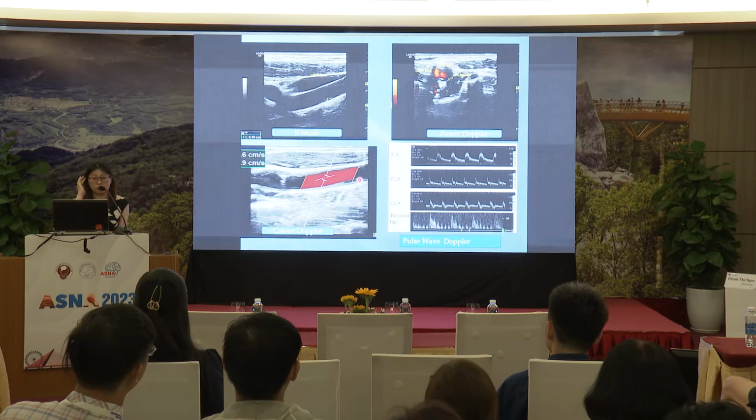You can use the temporal tapping. If the temporal tapping is positive, usually this is ECA. This is how to determine which one is ECA, which one is ICA.